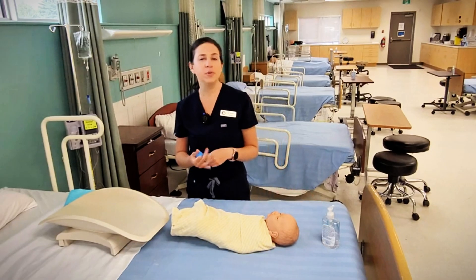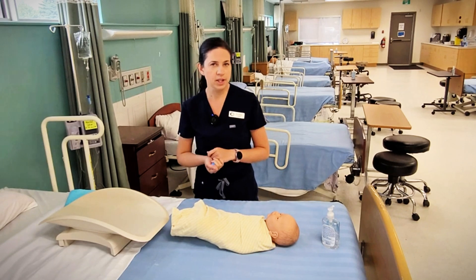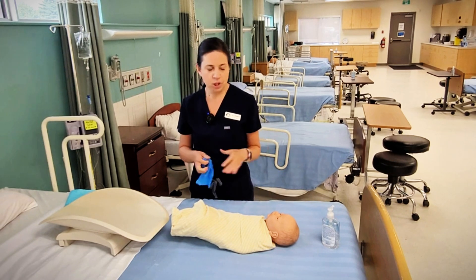We need to make sure we have a good accurate weight before the baby goes home. Babies can lose up to 10% of their birth weight before they can go home, so we need to make sure we have a good weight.